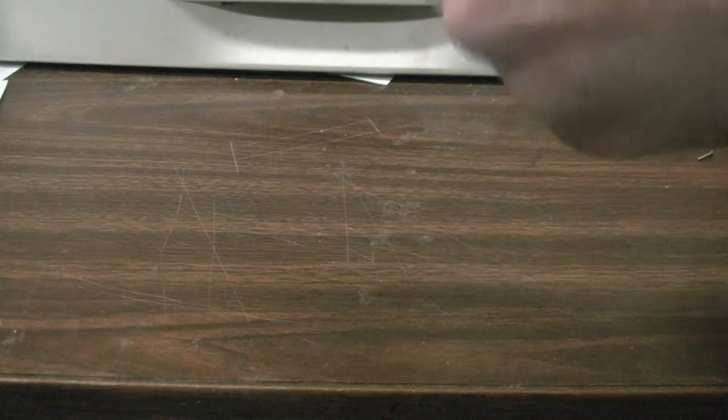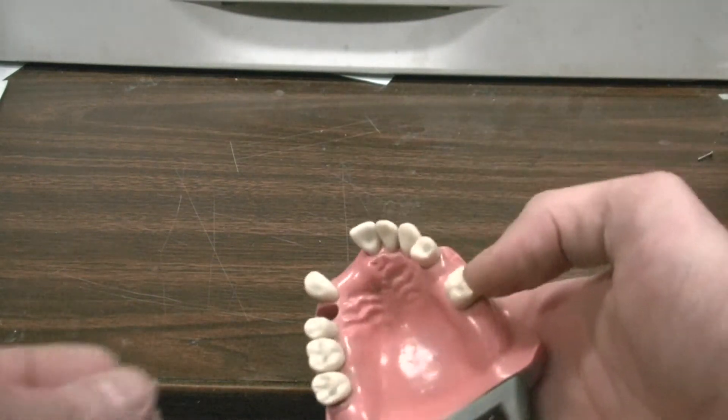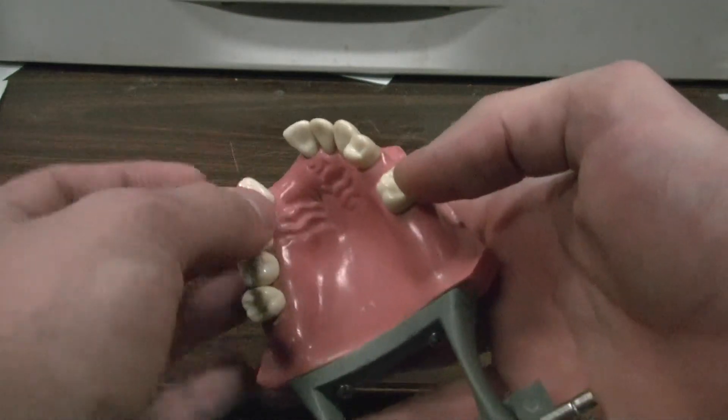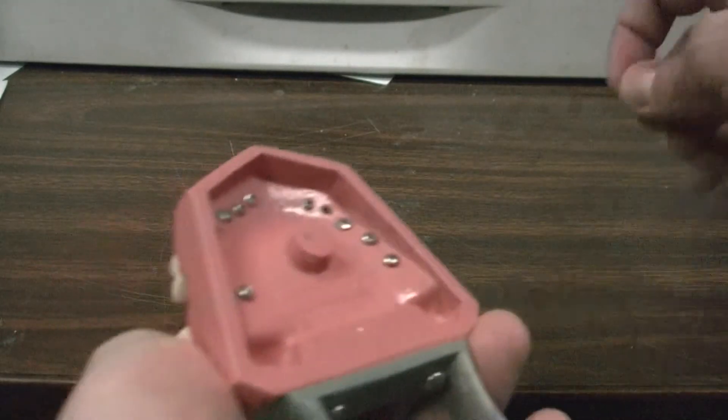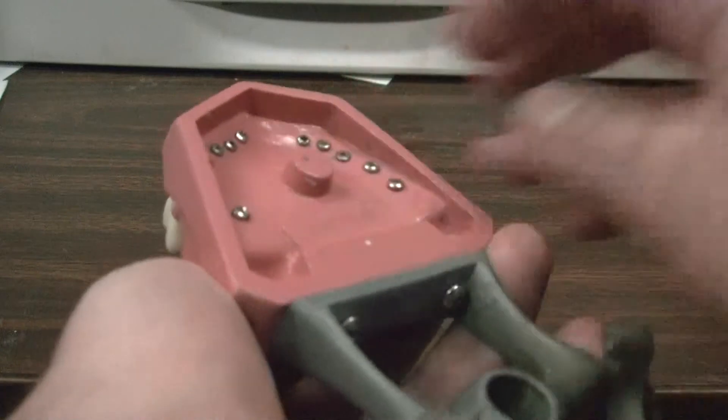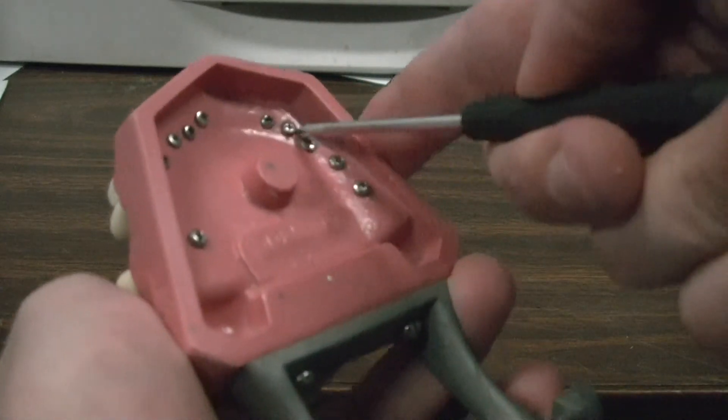First, what you do, instead of putting the tooth in and then screwing it in, you put the screw in and let the screw draw the tooth into the typodon.